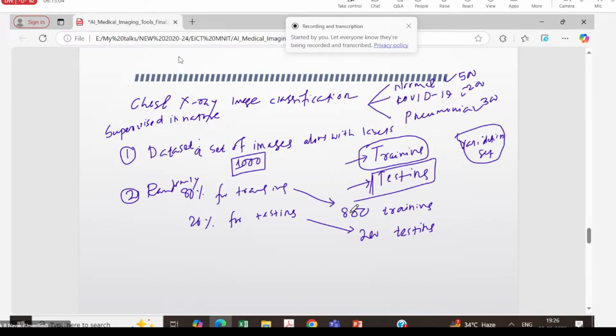You will also get 800 images, but we are giving the same importance to each of the classes. So if we are not applying 80% over each class, what will happen is that you may have a training set having 500 samples, or let's say 490 samples from class 1, 250 samples from class 2, and similarly the rest others, maybe something very less, right? I think 60, probably 60 is the third class. We don't want this. The dataset is not balanced already.